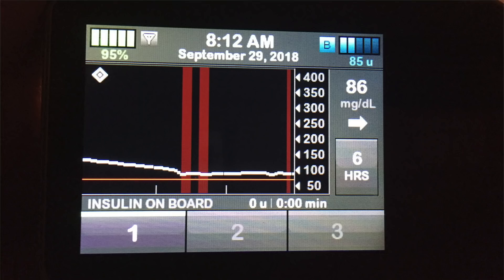I'll definitely insert some pictures of the screen of my pump. When you see red bars in my CGM graph, that is when the pump suspended. The Dexcom G6 gets a blood sugar reading every five minutes, so if it predicts that you're going to be low in the next 20 or 30 minutes, it will suspend your pump — or of course, if you're already low, it'll suspend your pump. The idea is that it minimizes or completely prevents the time that you're low. There have been times where my CGM trends towards the low line, it suspends, and it comes back up to normal — I never go low and I never go high. It can suspend and resume as quickly as every five minutes, so it can shut off for just five minutes and come right back on. I love how fine-tuned it is.